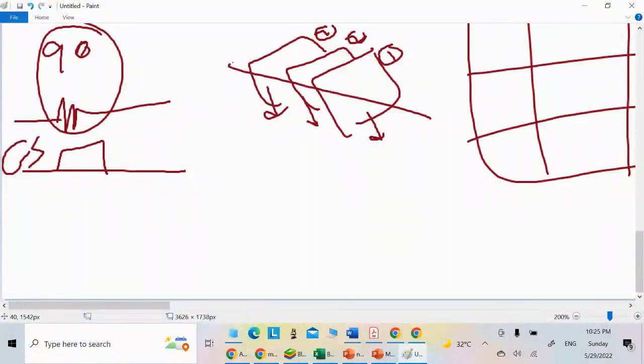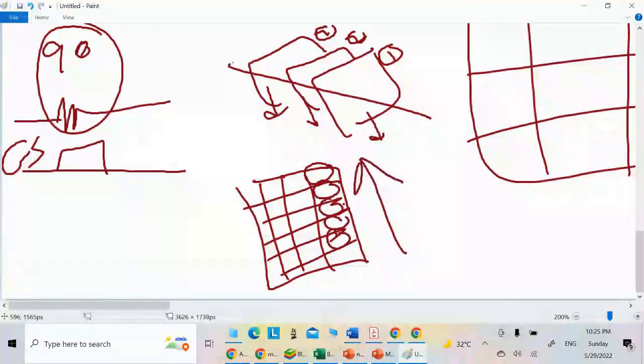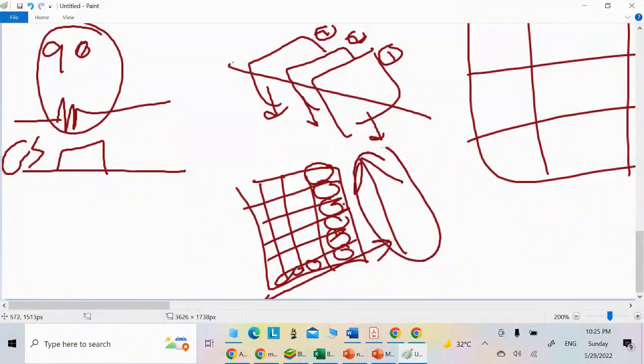All right, I will take slice 1, and I will find that it consists of columns and rows. The gradient will be applied in the y-axis for the proton, and a gradient will be applied in the x-axis. It is referred to in the y-axis as the phase encoding gradient.